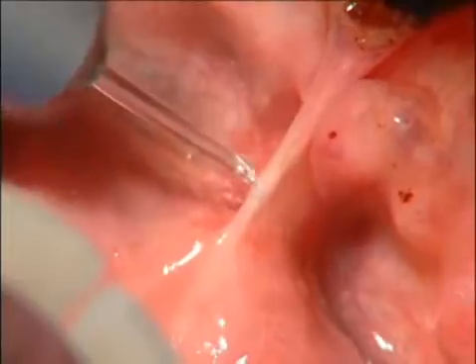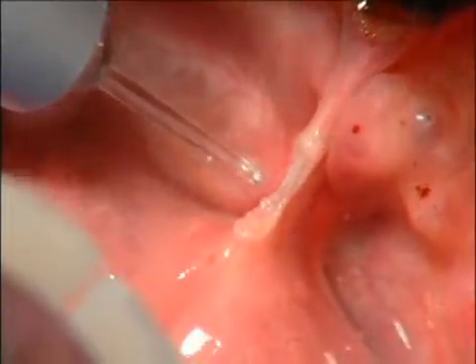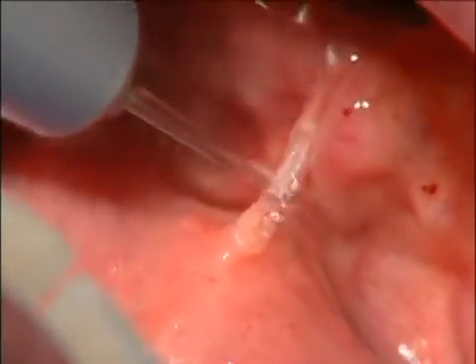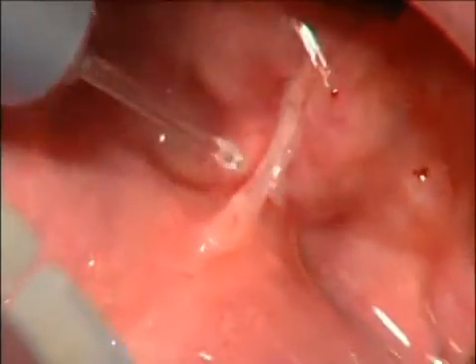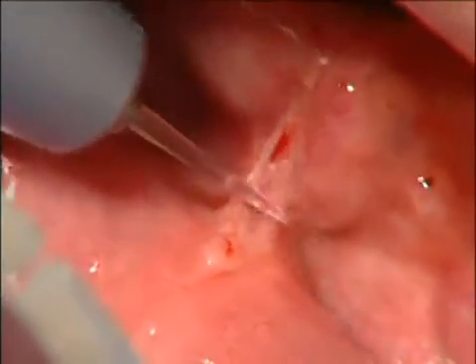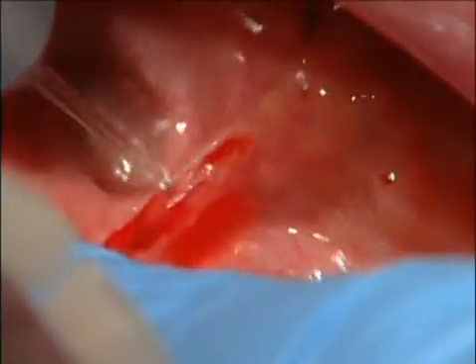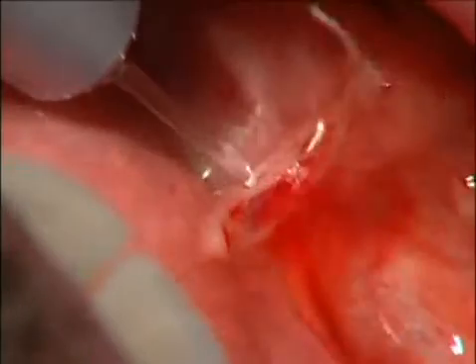If you've given a little anesthetic to make the procedure a little faster, you can up the power to 1.75 watts. You lower the water to 4%, and you'll have faster cutting and sometimes better coagulation. Now you can see in this patient at 1 watt, I'm cutting it fast enough. I mean, if I wasn't videoing, it would take me less than 2 minutes to do this procedure. There's a few red blood cells there and a little bit of water. So the bleeding is well controlled.